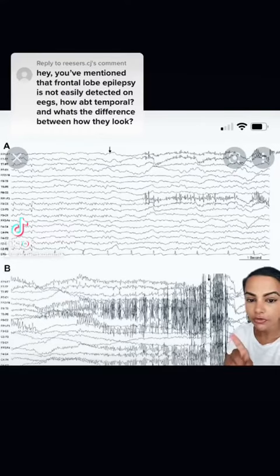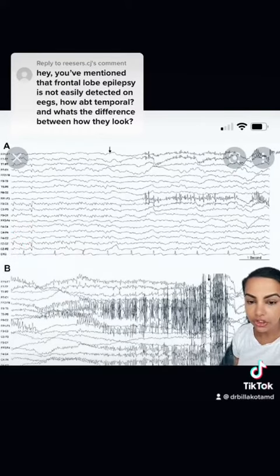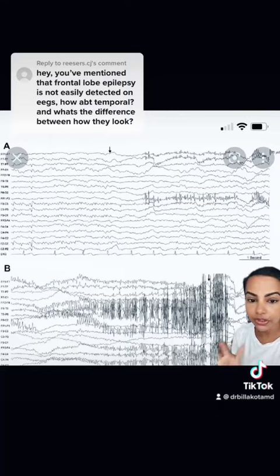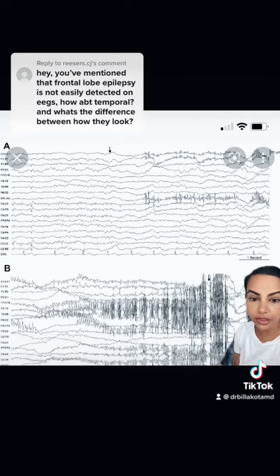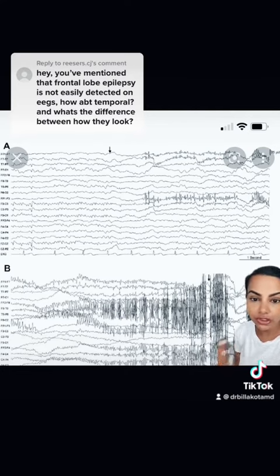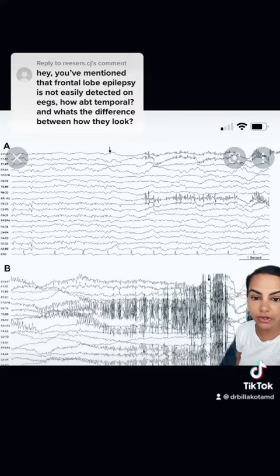This is what a frontal lobe seizure looks like on EEG — that's the bottom B panel. As you can see, there's a lot of movement artifact, mostly because these seizures are big erratic movements that can be brief. In between seizures, EEGs can look normal, which is the above panel.